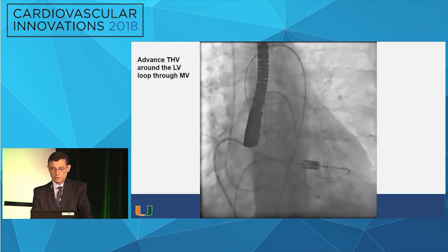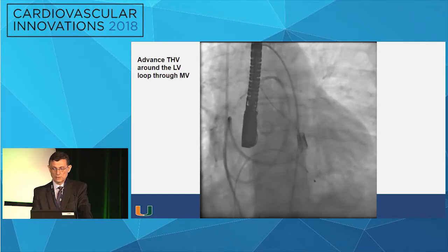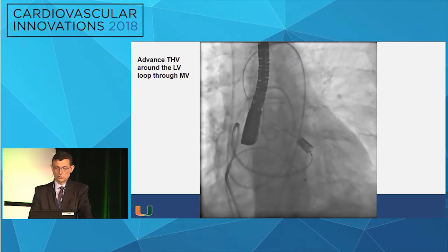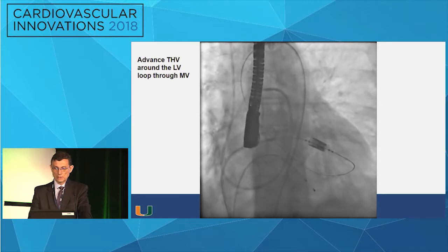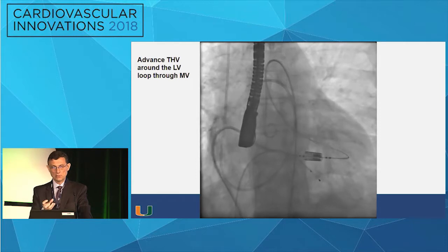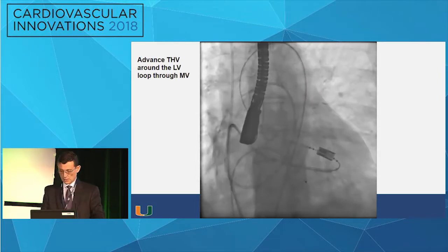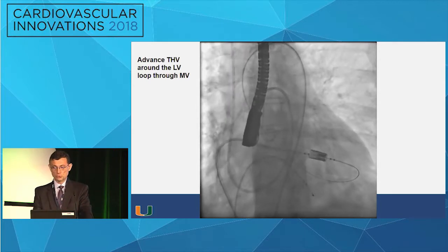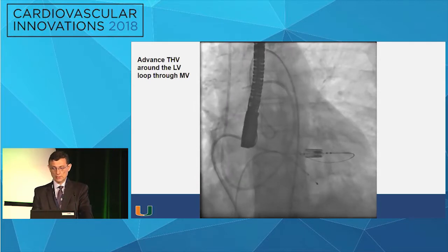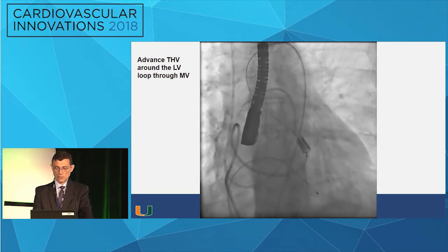So this is the critical part. When we are pushing the valve, somebody is holding a little bit of tension from the other side. The best part is when the loop is created and then everything reconstitutes, because there's torsion to the heart at that point, and the blood pressure just tanks until you recreate that loop, and then you get your transcatheter valve there in your ascending path.